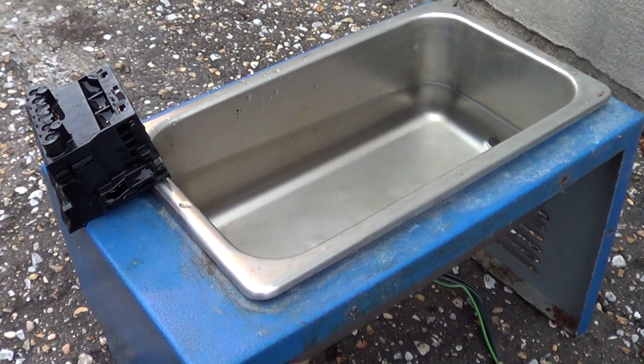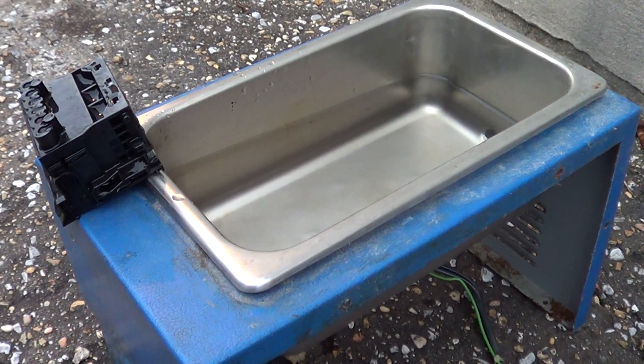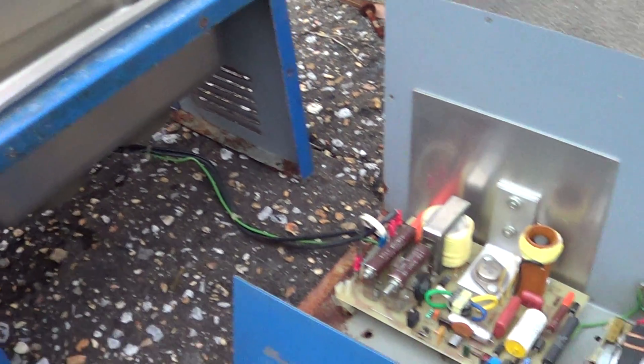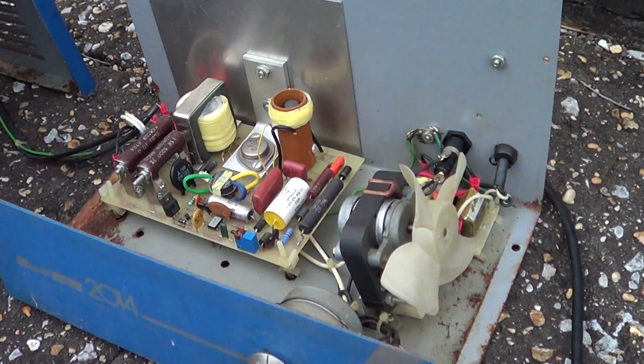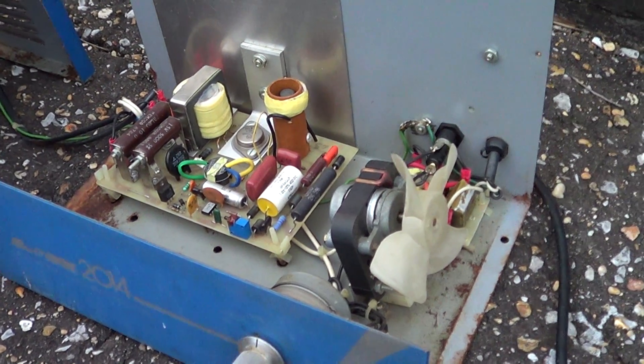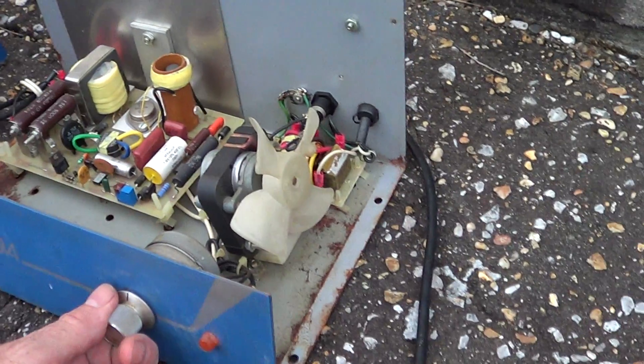This is the L&R 2014 ultrasonic cleaner. We've taken it out of the case here because while it was running, a bunch of smoke came out of it and stunk up the place. Got it outside here, and it's hooked to a ground fault.